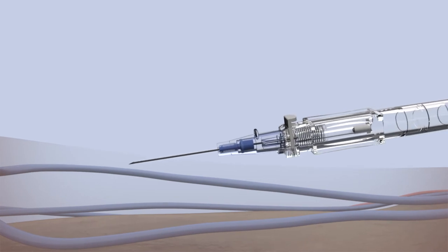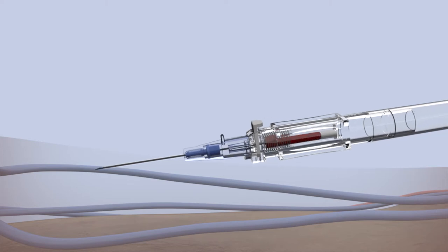Immediate blood flash can be observed in the initial flashback chamber, confirming successful venipuncture. Advance the device into the vein. Successful venipuncture can be confirmed by visualizing blood flow in the secondary flashback chamber.